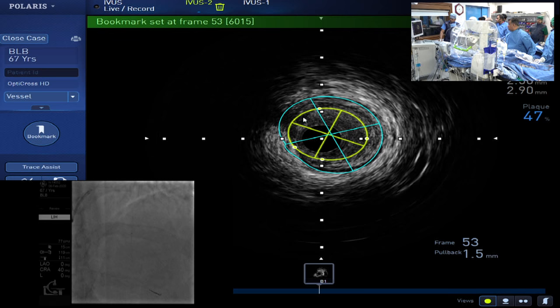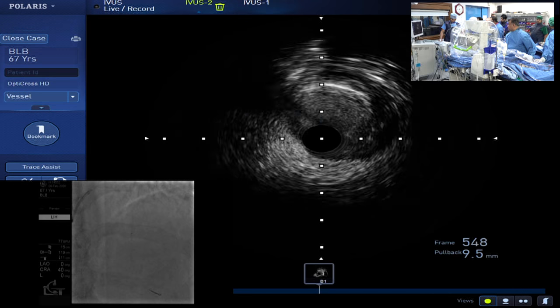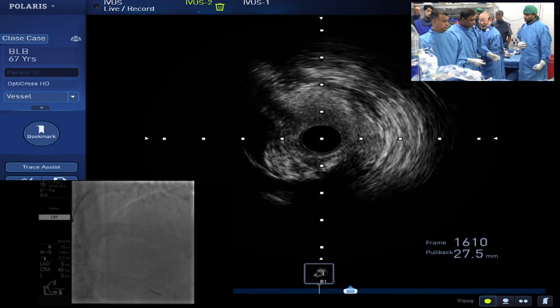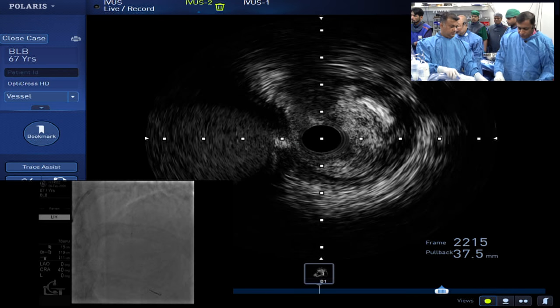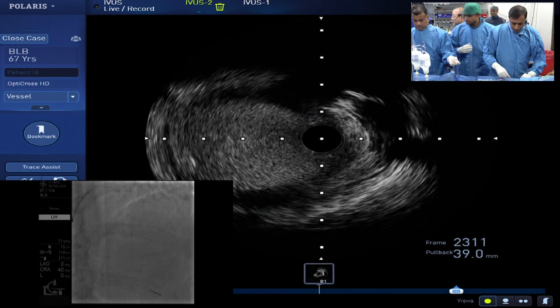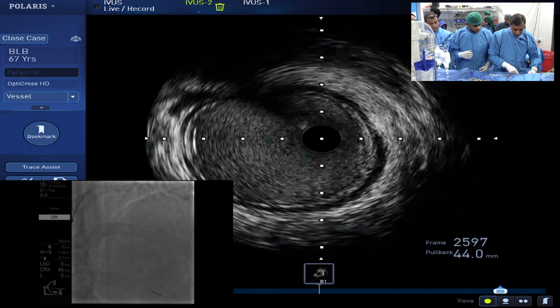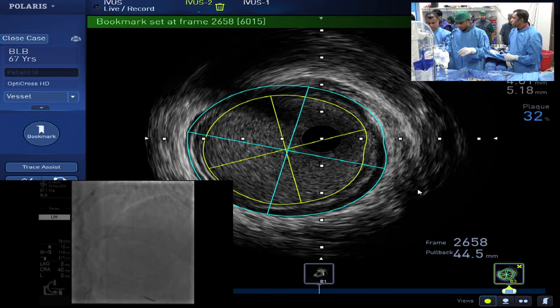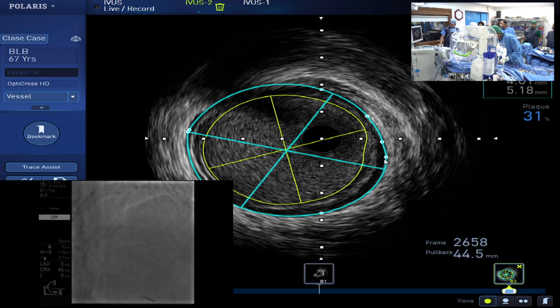I see. Okay. It might be okay if you put it in very gently to protect the distal portion, and then we size, can dilate. Length? We are now trying to make the length, right? Take a longer one? Yeah, a long one. So the approximate range of the ostium of the left main, yes, much more. The crossover in the CX, from left main to LAD. So here is the left main. Basically, you've got to go from 4.5 to 3.0.